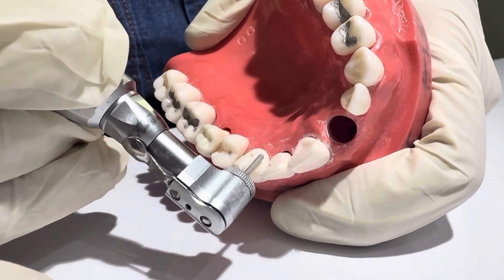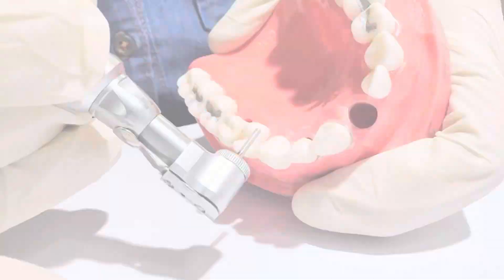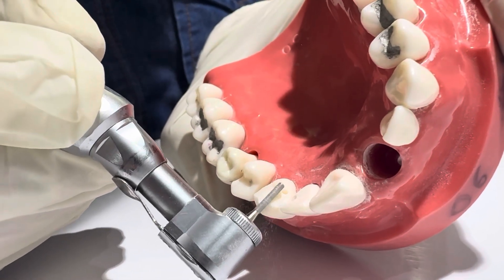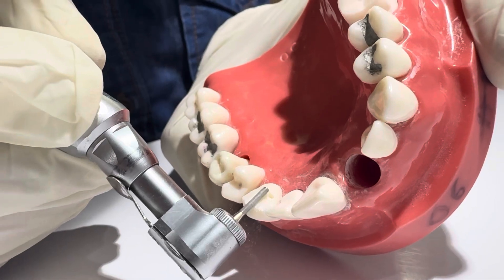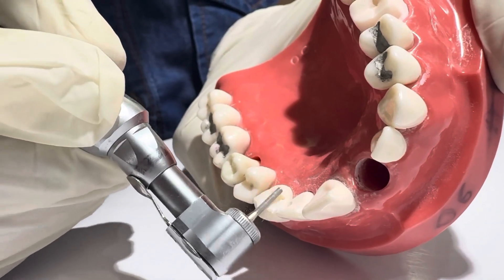Step 3: Lingual reduction. Reduce cingulum area 1 to 1.2 millimetres. Create a concave lingual clearance with a football or flat-end burr. Functional surface reduction for occlusion, especially if opposing mandibular incisors contact the lingual surface.